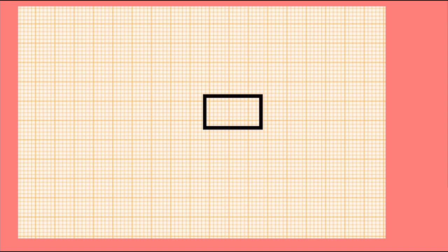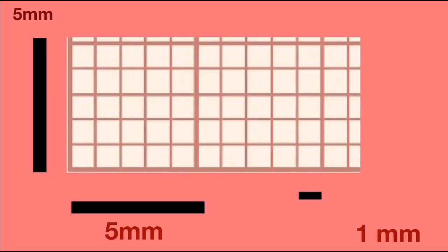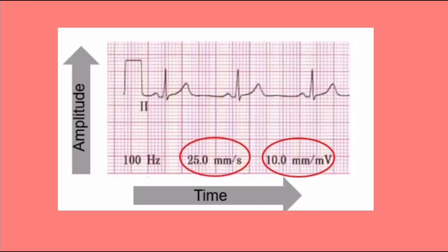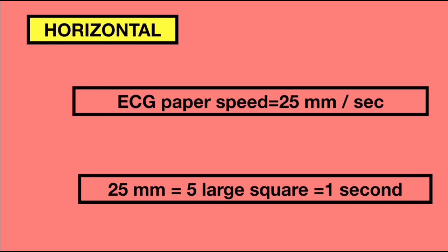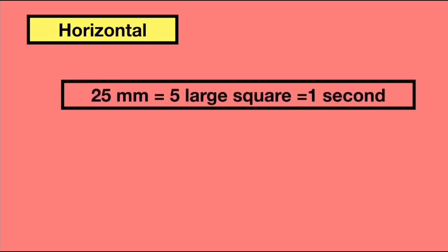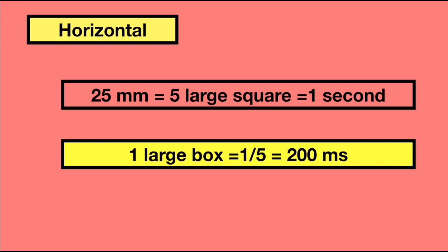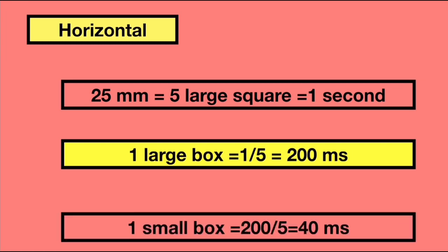This picture shows a normal ECG paper consisting of small and large squares. One large square is 5 mm and one small square is 1 mm. The horizontal axis measures time and the vertical axis measures voltage, that means amplitude. At the start of the ECG, you can see a calibration signal with a height of 10 mm which equals 1 mV. You can also see the speed of ECG paper as 25 mm per second. So in the horizontal axis, 25 mm equals 1 second, which equals 5 large boxes. Therefore, 1 large box equals 200 ms and 1 small box equals 40 ms.